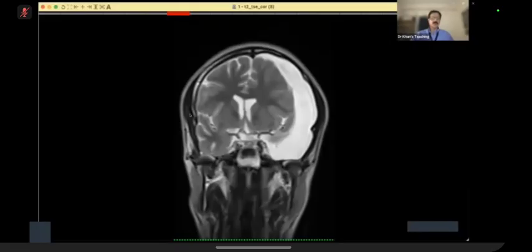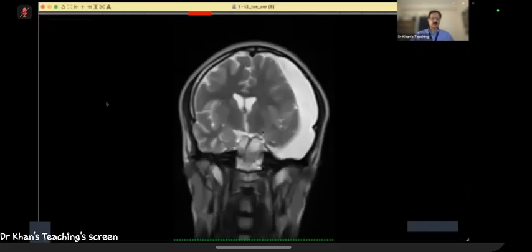Okay, now somebody has asked, is it ruptured? No, it has not ruptured.